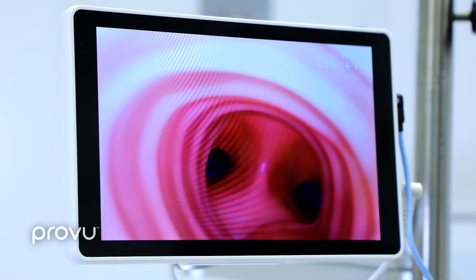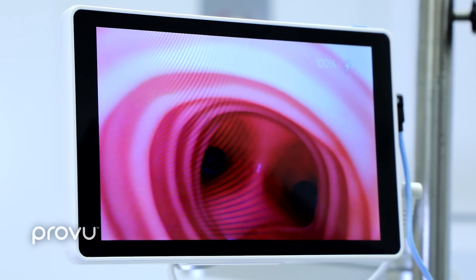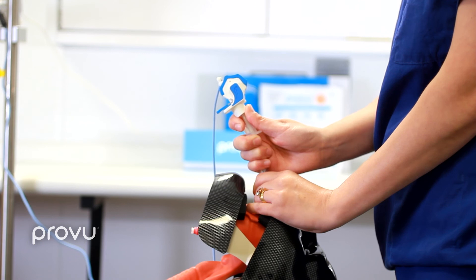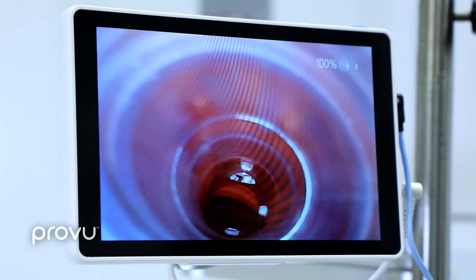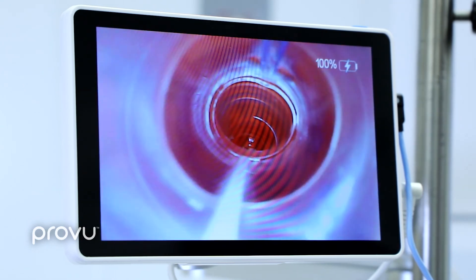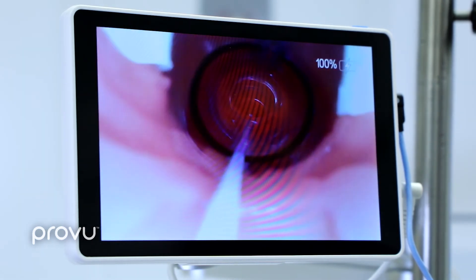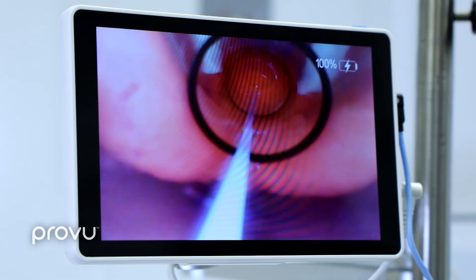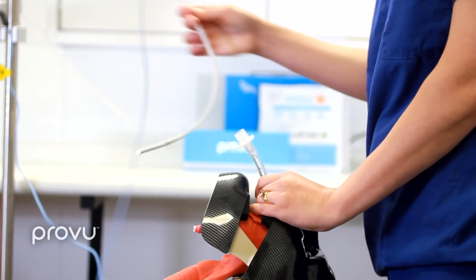Now that I've confirmed I'm in the correct position, I can remove the video stilette. As I come back and look through the tube, I can see the black lines and check where they sit in relation to the cords. There's one black line, and we can see it sitting between the cords, and there's the second black line. The patient is ready to ventilate.